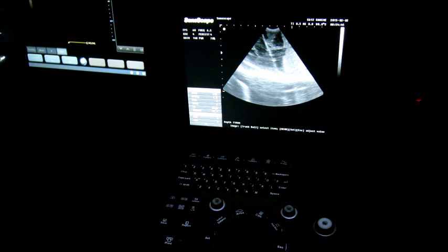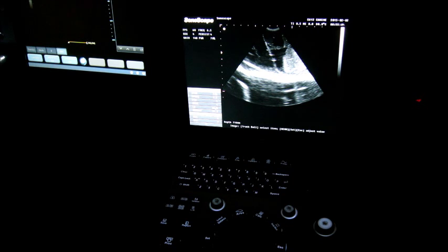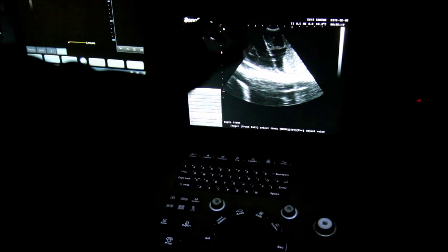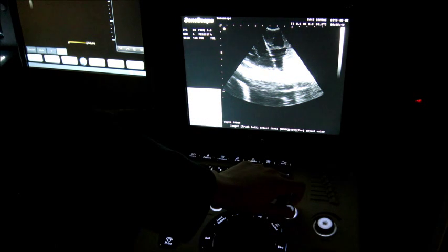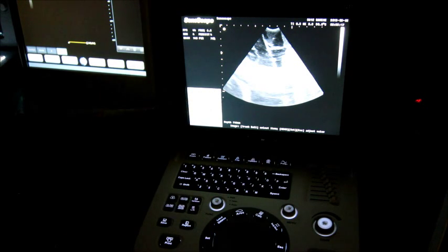So if I just demonstrate that to you here, you can see this image is looking pretty milky, quite washed out. If I decrease the dynamic range on the A5 here, I hope you can see that you now have a lot more contrast in your image. So I find that helps if you're doing an initial search for gestation sacs. To have a slightly lower dynamic range can often help because you can really help your eyes to pick out those shapes. Once you've found your region of interest, you can always increase your dynamic range so that you can see a lot more detail in the tissues.